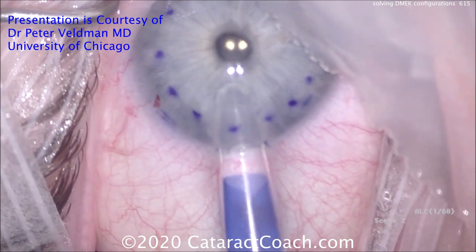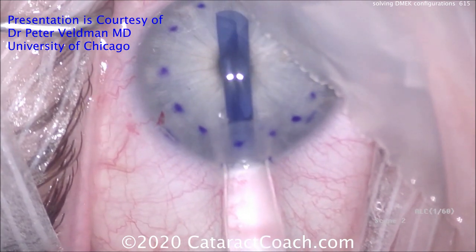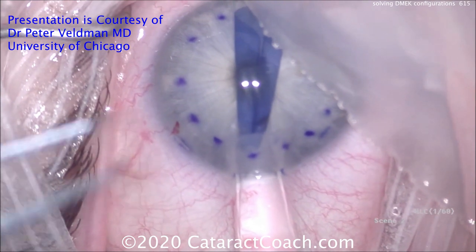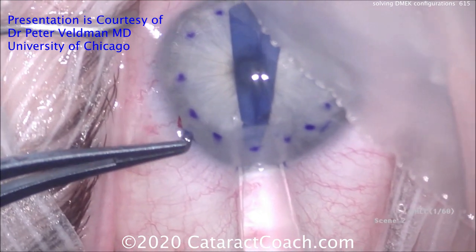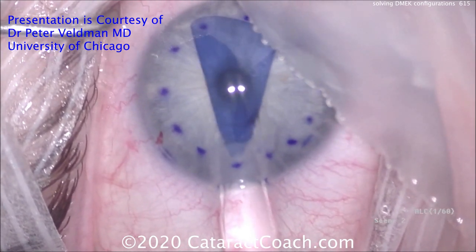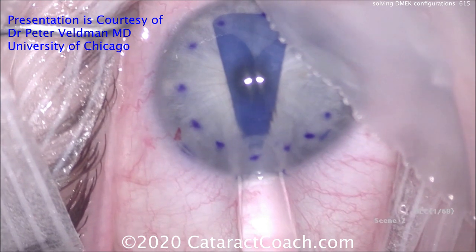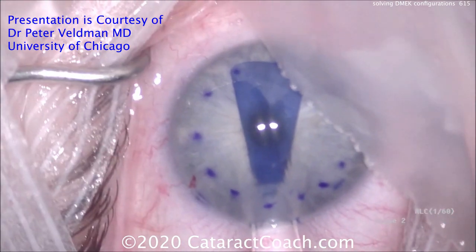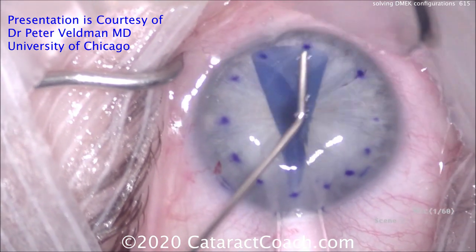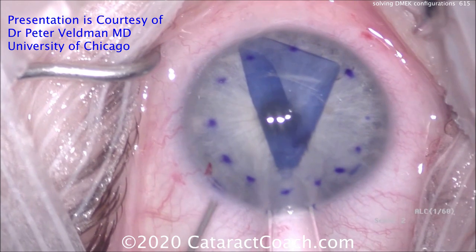He's going to insert a DMEK graft here — Descemet membrane endothelial keratoplasty — and it goes in the eye nice and easy. There's the Jones tube right up against the incision, using the second hand to flatten out the anterior chamber by tapping on that paracentesis. With that lower anterior chamber pressure, this graft wants to stay in place a little bit better. Notice the Jones tube is still there at the incision, tapping right in the center to send little fluid waves across. That helps to open the graft.